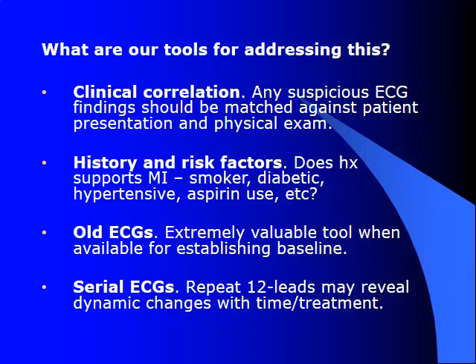If our ST elevation is worsening through time as we travel with our patient to the hospital, that's a pretty good indicator that they're experiencing an acute event. And if we improve their ST elevation with nitroglycerin usage, this is also an excellent indicator of an event that is acute.